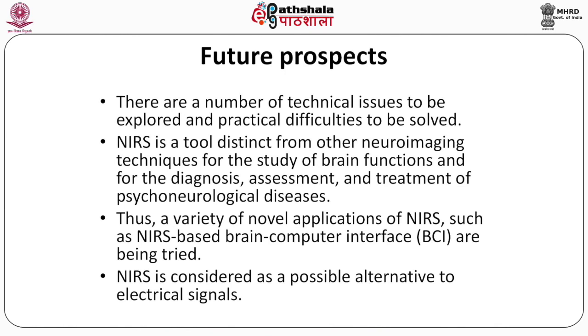There are a number of technical issues to be explored and practical difficulties to be solved. NIRS, that is near infrared spectroscopy, is a tool distinct from other neuroimaging techniques for the study of brain functions and for the diagnosis, assessment and treatment of psychoneurological diseases. So, it could be studied in those diseases which have not been explored yet.